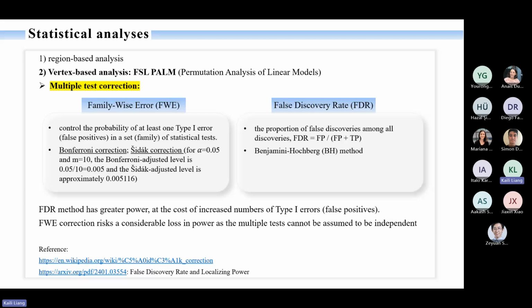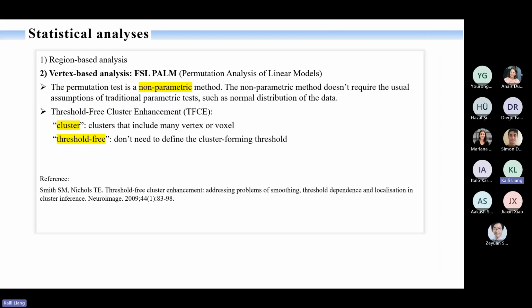It has very different effects: for some subjects you might have an enhancement where your signal is boosted up to, I don't know, 300, and in another metric it might go up to thousands. And if you're comparing them, when the distributions are combined, it affects your p-values.